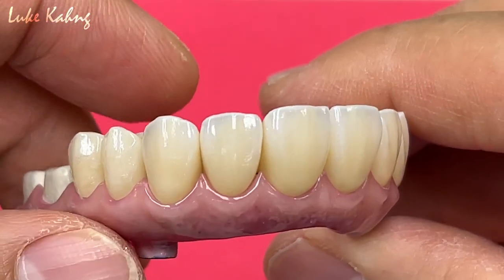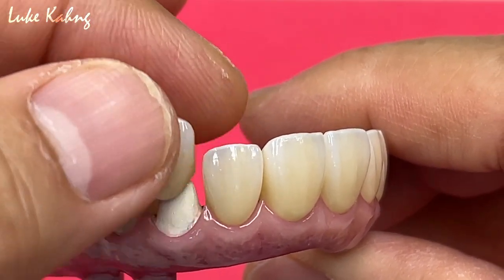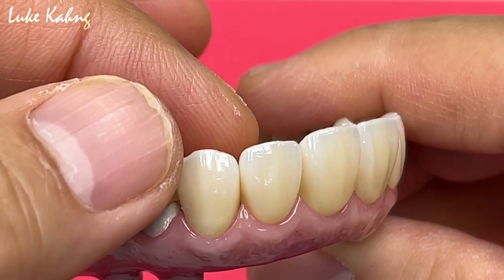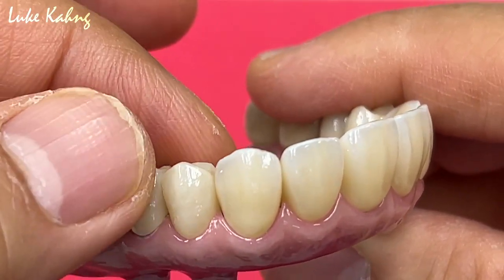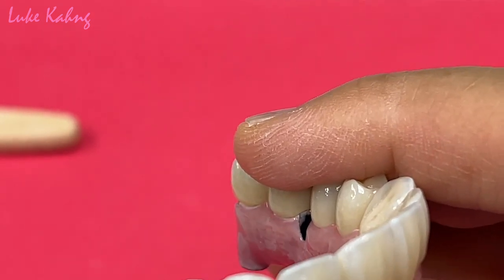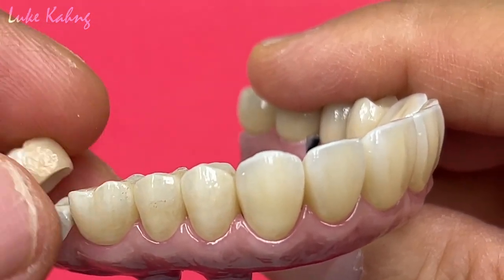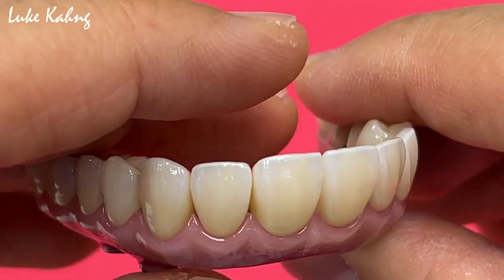So we made them single because this one is more aesthetic. So the patient can floss too. It's very imperative before we go to cement.